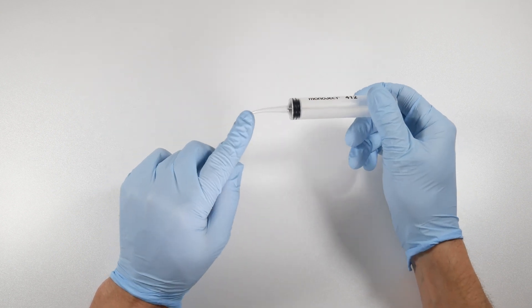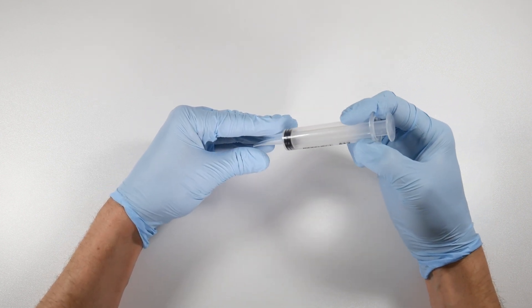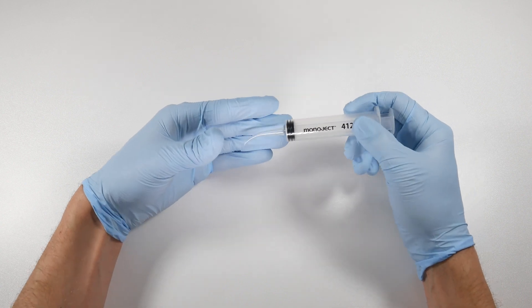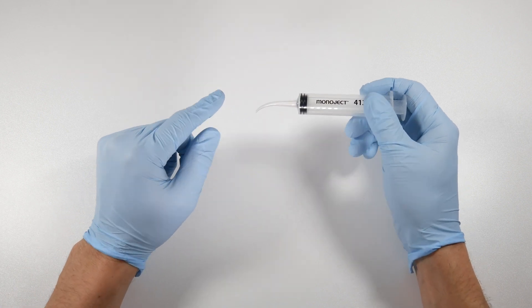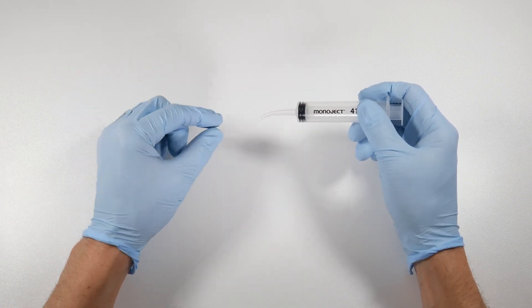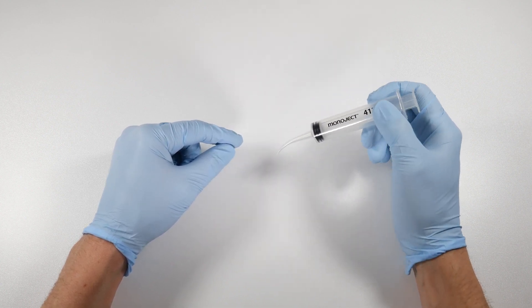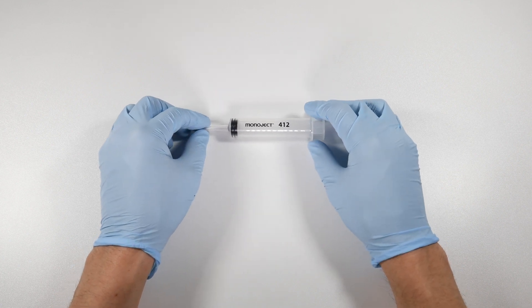It also allows you with this small tip to get way down when you open up a flap, you can get way down to the base of it. That's very important because think of where all the debris goes—gravity is pulling it down into the base of the flap. So this in combination with a small tip suction will allow you to fully clean out underneath a flap that you raise to make sure that you don't run into these delayed post-operative infections.